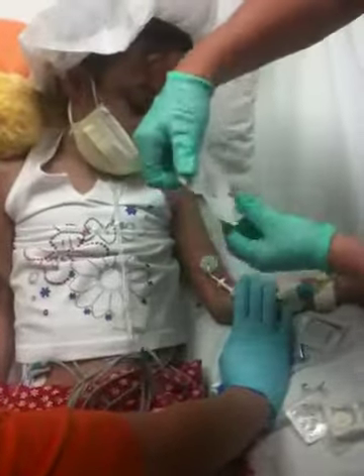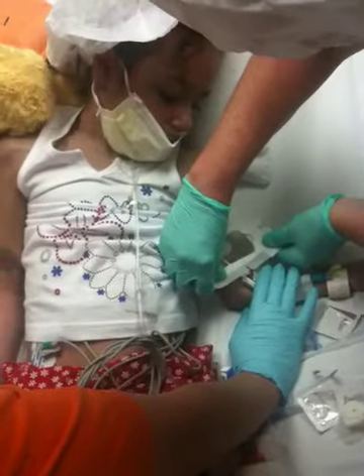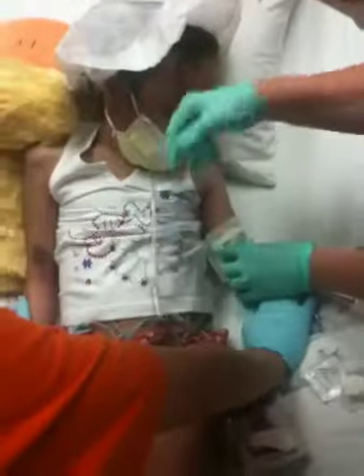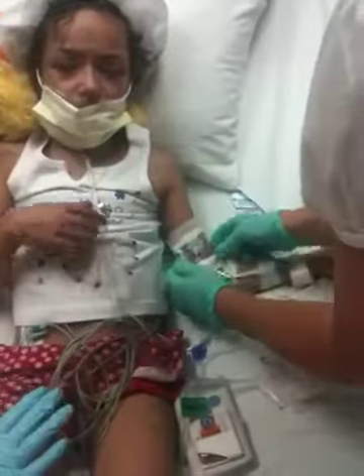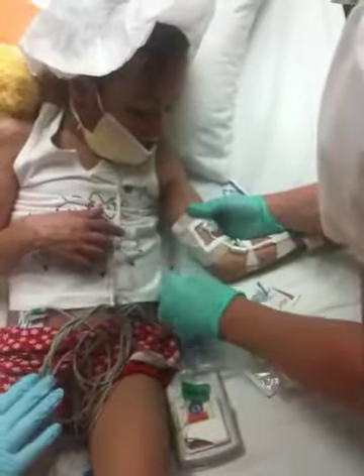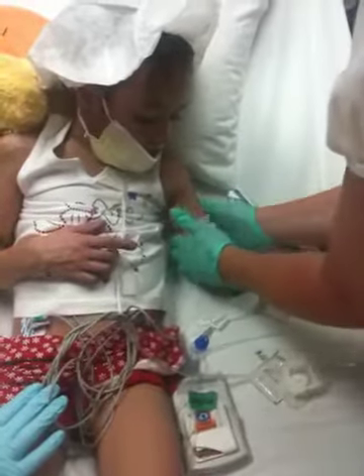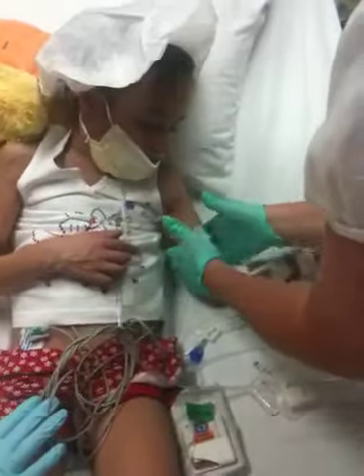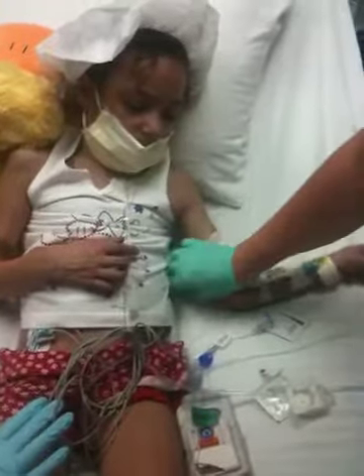Well, I really wish I would have done it when she pulled. Ready? I'm squished. The biopatch is squished. Oh, that's okay. The biopatch is squished. Mrs. Biopatch, I'm sorry. You're squished. Don't worry. Are you squished? Next one, please. Okay. She's nice.